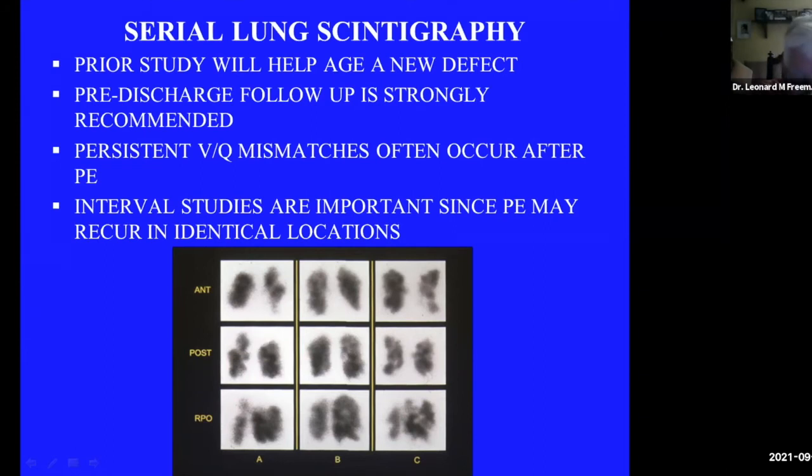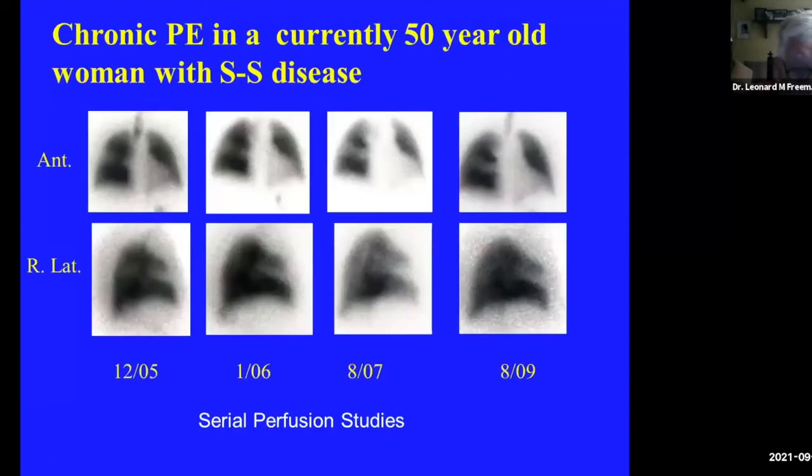And I advocate two things. Number one, every CT. I don't think you want to keep doing CTs on patients. Every CT scan that's positive should have a baseline VQ for follow-up. And also, any patient that's got a DVT should have a baseline VQ scan as well.